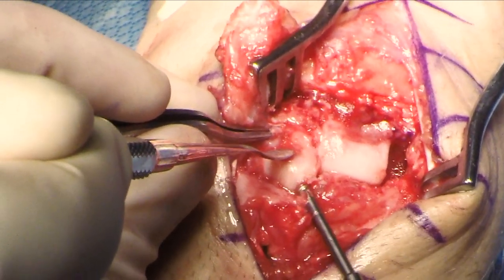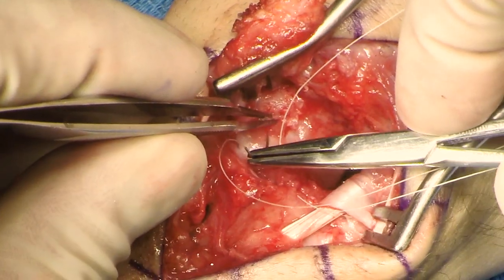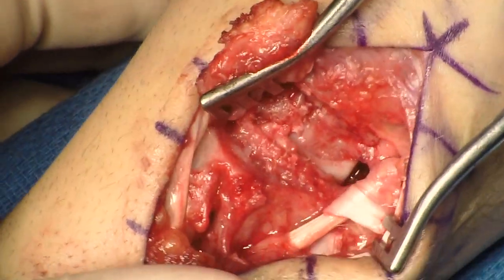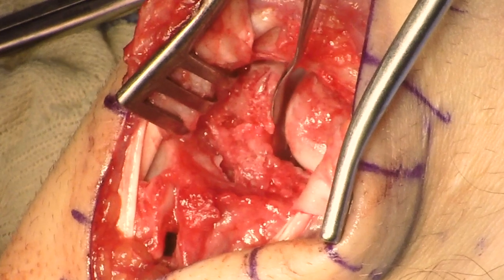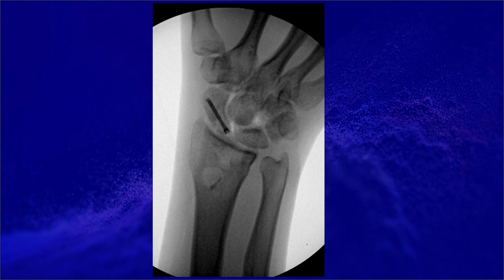A 2.2 millimeter headless compression screw is then inserted. The scapholunate ligament and the ligament attached to the graft are then approximated and secured with a 4.0 non-absorbable suture. The reconstruction is then inspected along with the articular reduction. The capsulotomy is closed with three Vicryl sutures. Final fluoroscopic images show placement of the graft and the screw, as well as reduction of the scapholunate interval. Though a K-wire was not used in this case, placement of a scaphocapitate or capitolunate wire is an option.